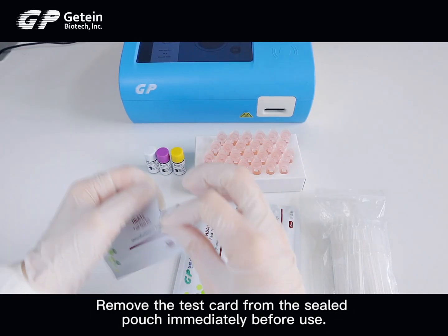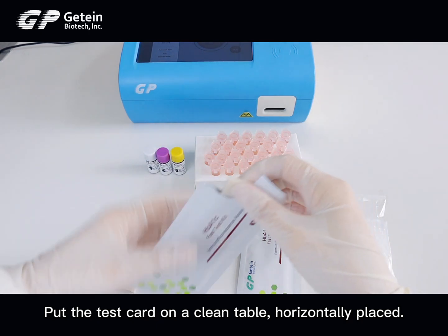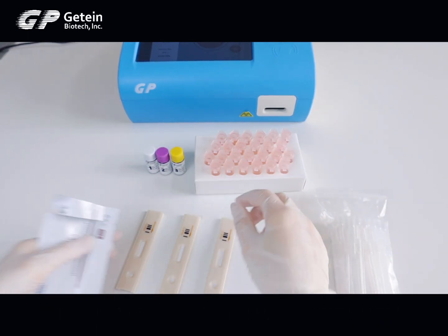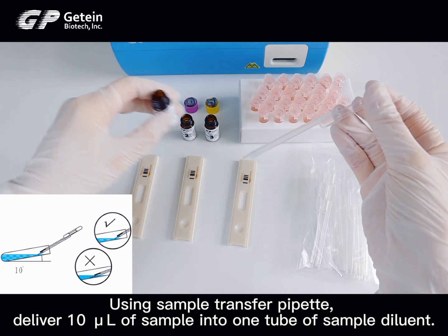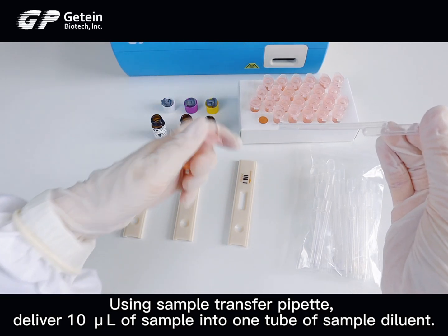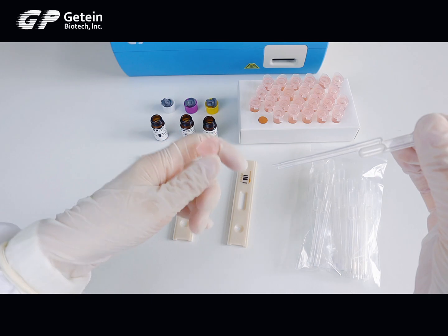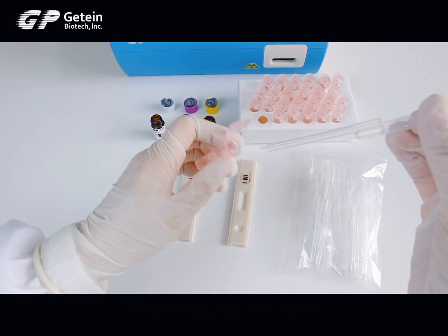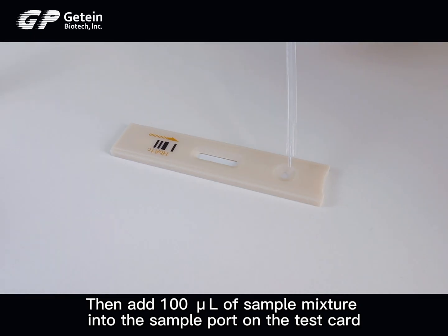Remove the test card from the sealed pouch immediately before use and place it on a clean table horizontally. Using a sample transfer pipette, deliver 10 µL of sample into one tube of sample diluent. Mix gently and thoroughly, then add 100 µL of the sample mixture into the sample port on the test card.